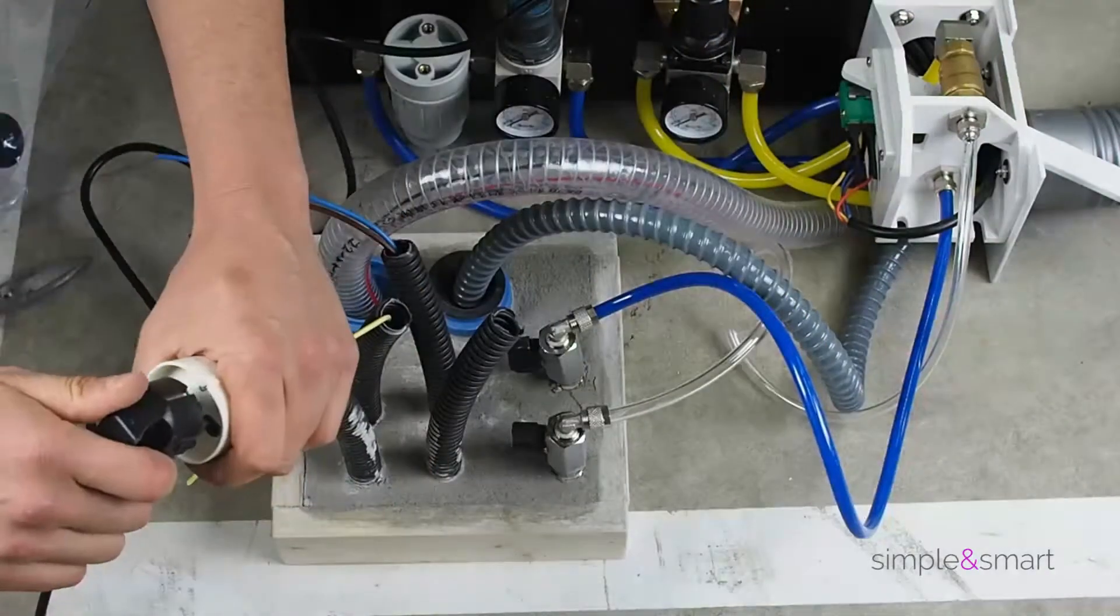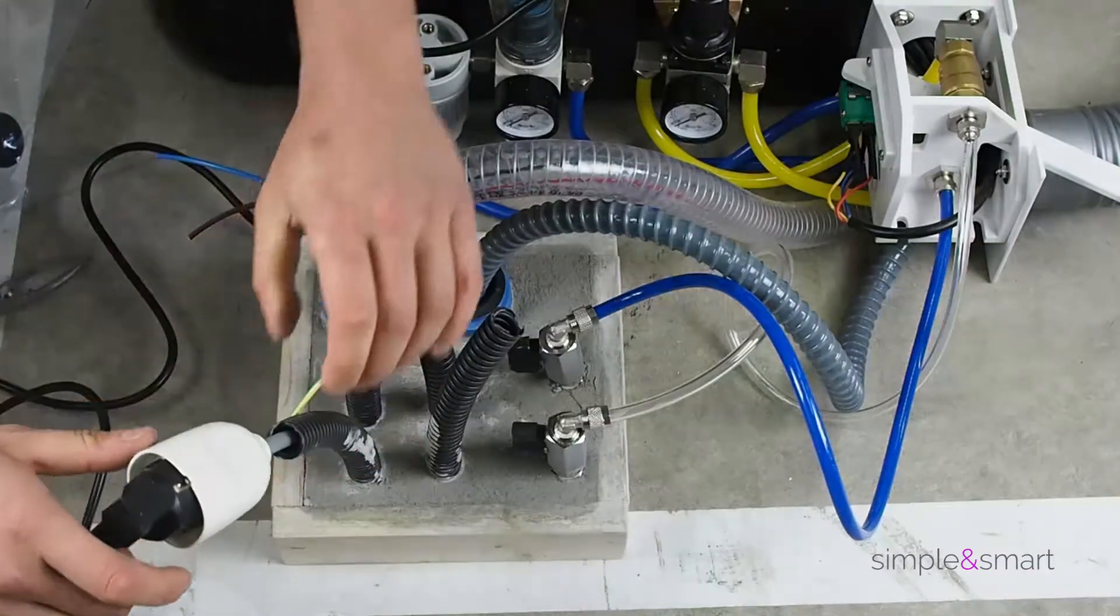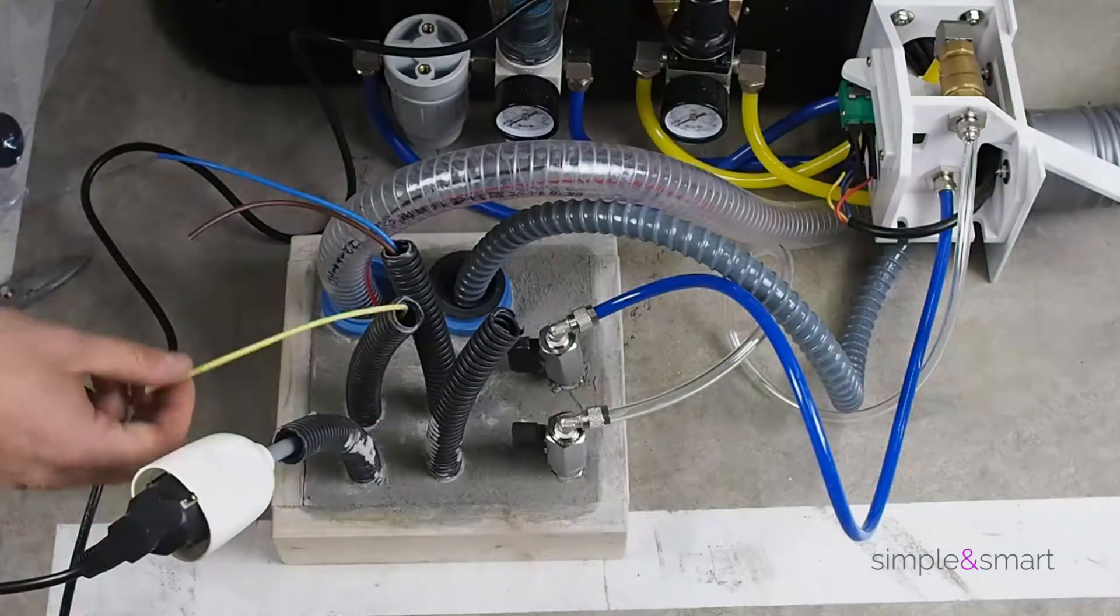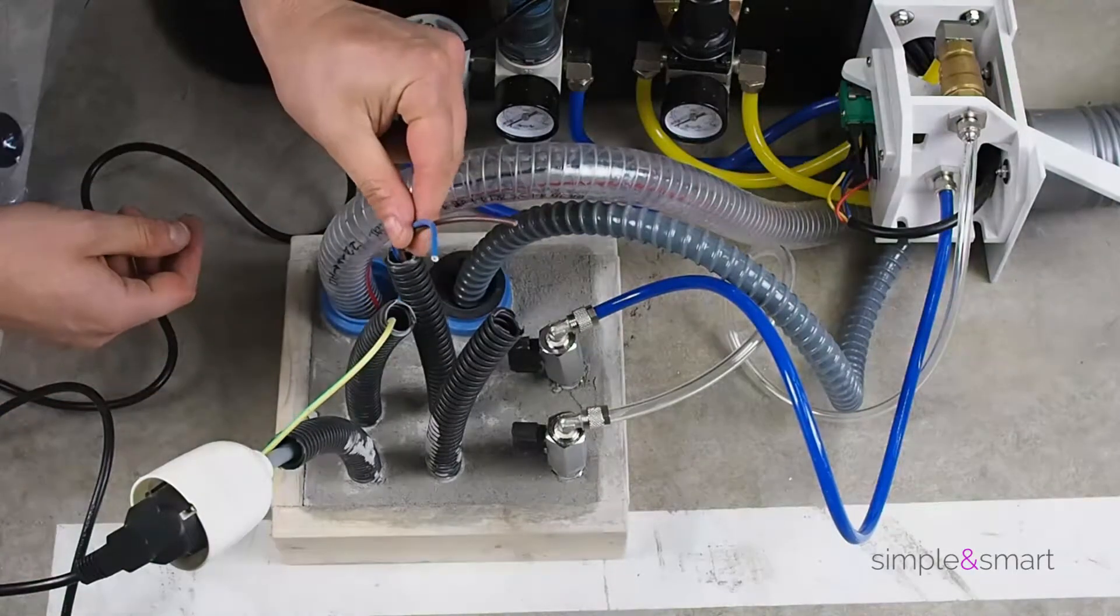Connect the unit to the electricity. Link the ground at the unit metal base and join the suction wires to the connector.